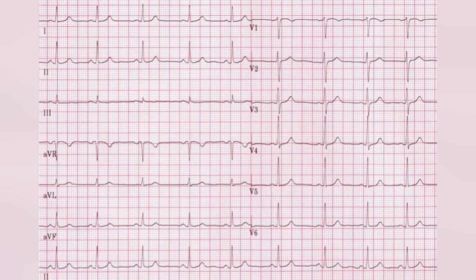ECG is a non-invasive and safe procedure that plays a crucial role in diagnosing and monitoring various heart-related conditions, allowing healthcare professionals to provide appropriate care and treatment to patients with heart concerns.